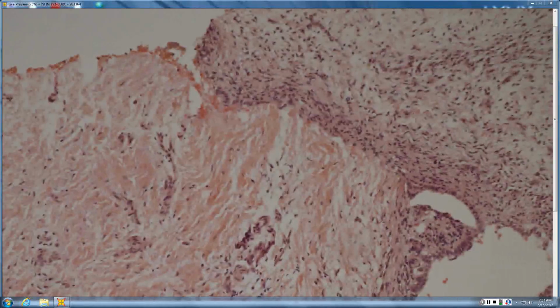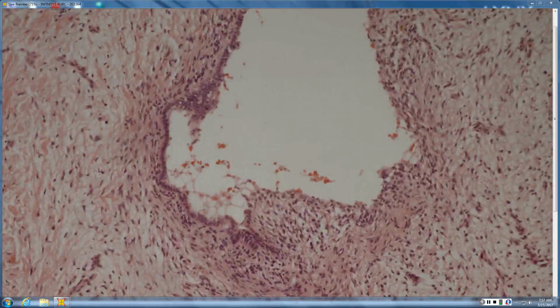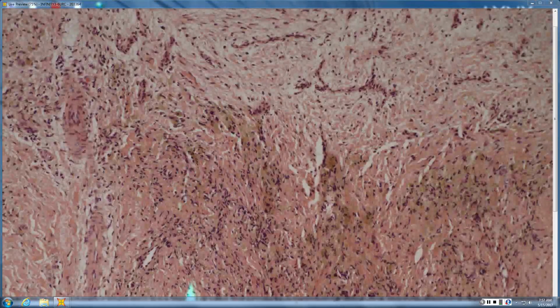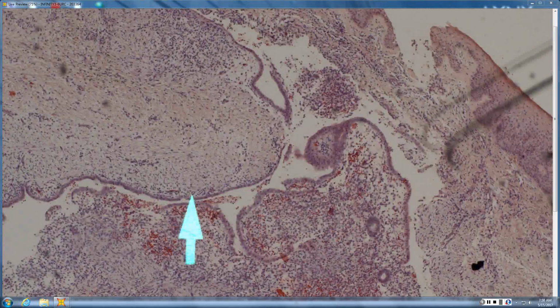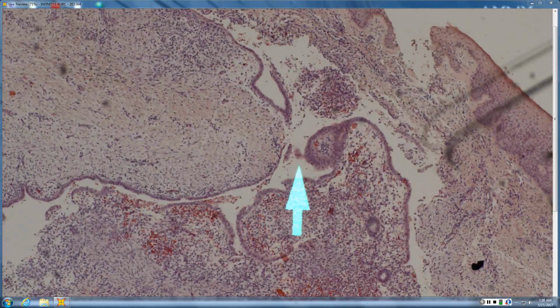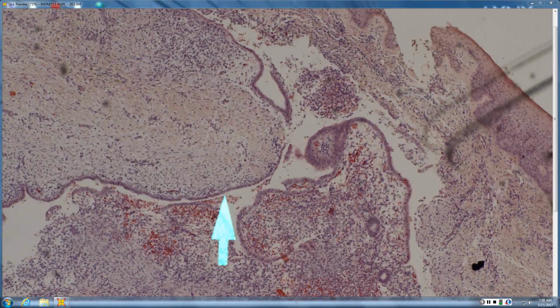That looks like endometriosis. You have a columnar epithelium, you have a fibromyxoid stroma with lots of red cell extravasation, lots of hemosiderosis. This is another endometriosis just to reinforce: the epithelial layer is columnar, fibromyxoid stroma, lots of erythrocytes. When it decidualizes, this little columnar layer stays but becomes kind of squashed, and the stromal cells become large epithelioid cells in decidualized endometriosis.